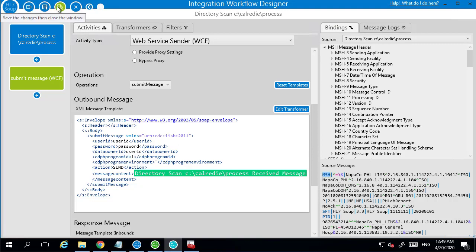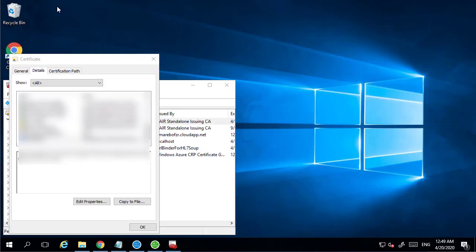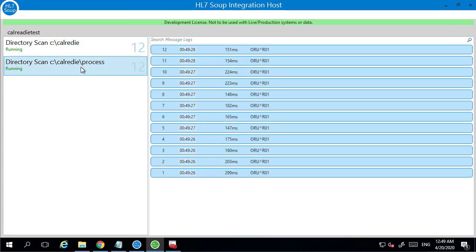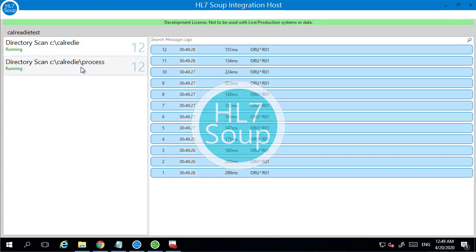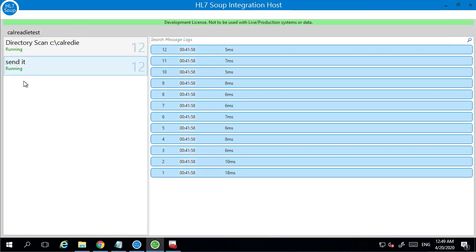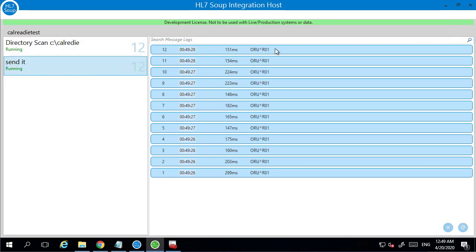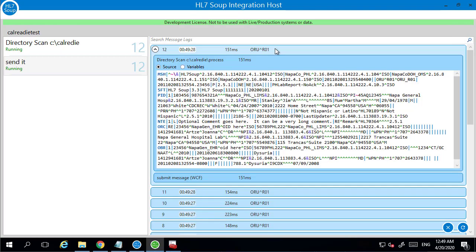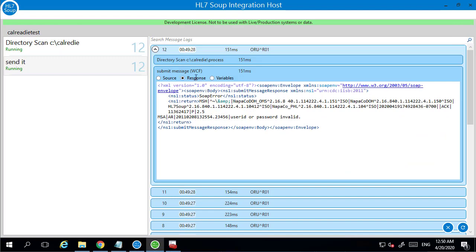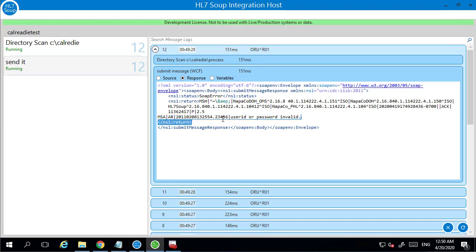So if I now hit save and close, this is going to start processing. Go back to Integration Host. You can see it's already actually processed 12 messages. I could have named that a bit better. Hang on, let me just rename that. Send it. Just make it a little bit easier for you to identify the difference between the two of them. And then, so here we can see the logs of what's actually happened. Click on that. And it's taken those messages, it's picked up the HL7. And the second step is it's actually sent it through. And there's the message that it's sent through. And here is the response we've gotten back. Now of course, it's given us back an invalid username and password. But we have successfully sent them a message. If we put in the right username and password and we've made a valid HL7 message, then that will work. Once we've got the username and password in, there is probably one other thing that you really have to keep in mind.